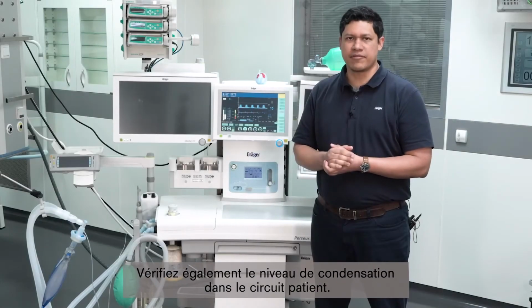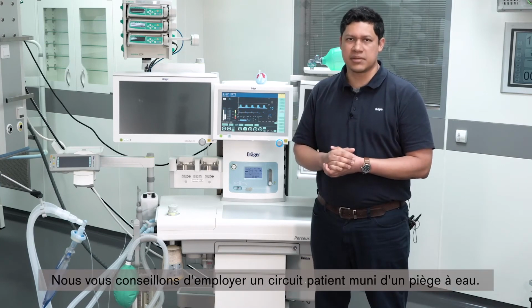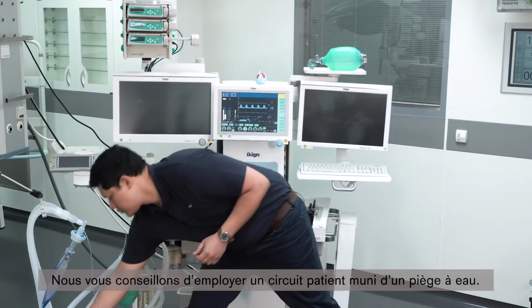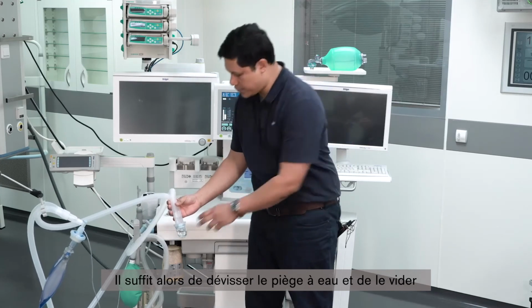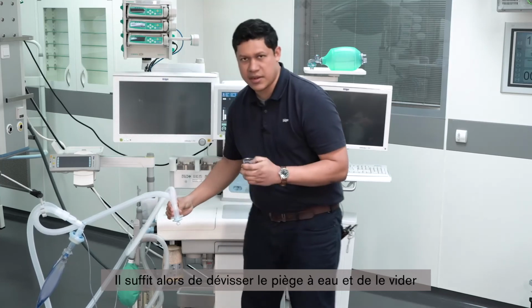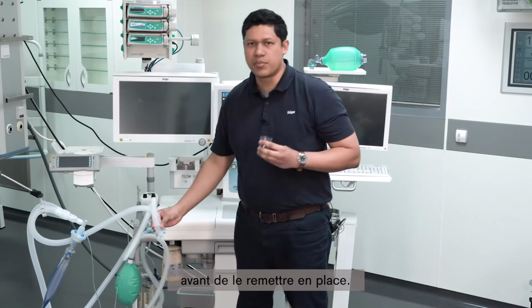Additionally, you have to verify the condensed level of water in the breathing hose system. The recommendation is to use a breathing hose system that has a water trap. To drain it, just turn the water trap and directly drain it. Then put it back on its place.